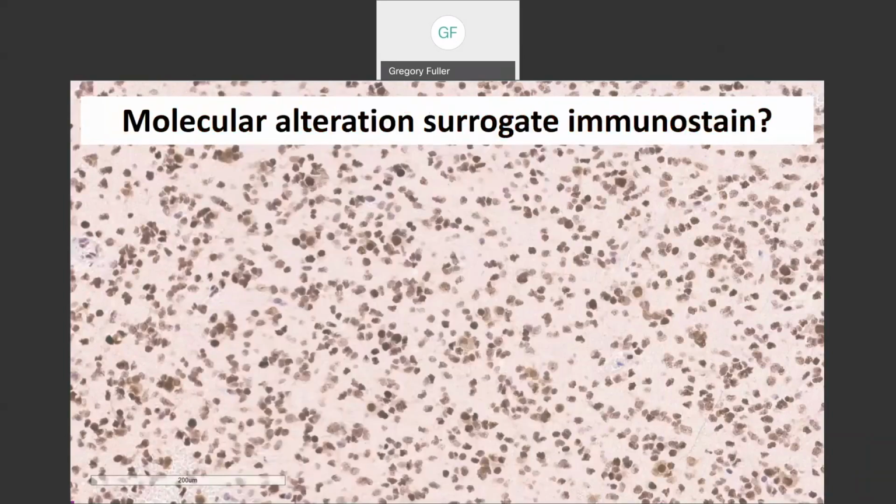All right, next question. Molecular alteration surrogate immunostain. What is the immunostain? You absolutely can get this. Okay, Dr. Harb, we've got P53. P53 is an interesting guess, because you see nuclear. All right, I think Dr. Cathcart just says ATRX. Yes, Sergio, ATRX. Esther Bediven, yes, ATRX. ATRX seems to be winning. Good job. Why do you know it's ATRX?